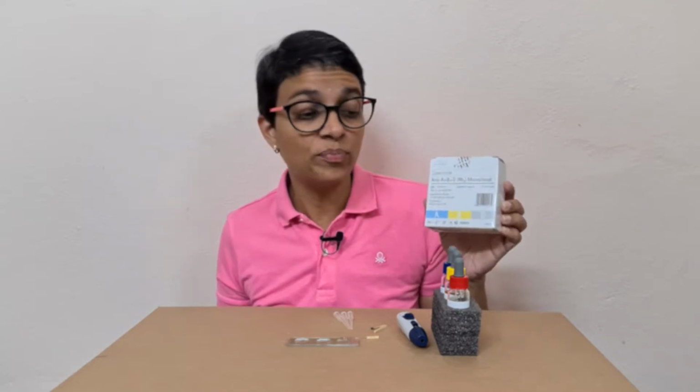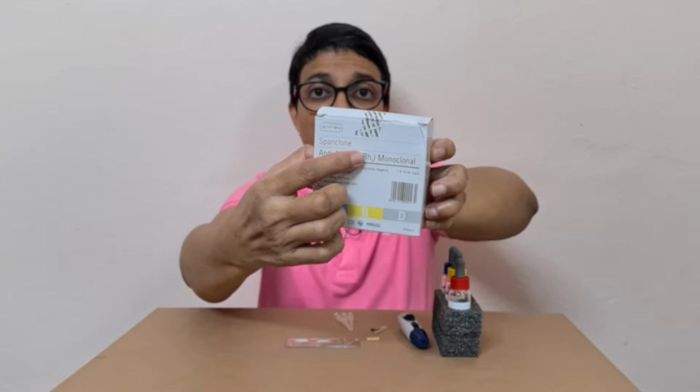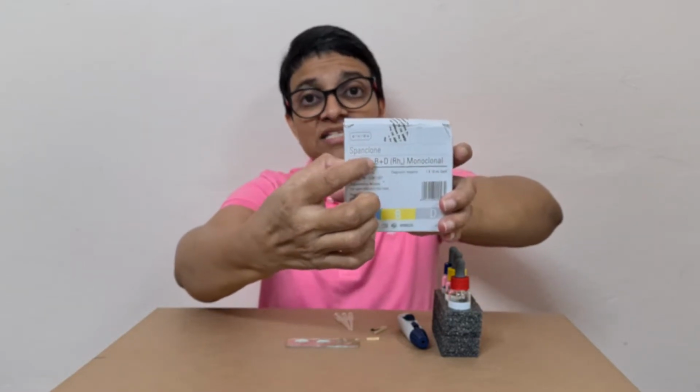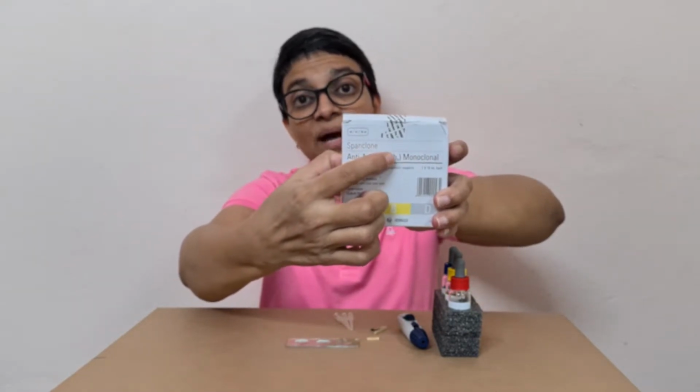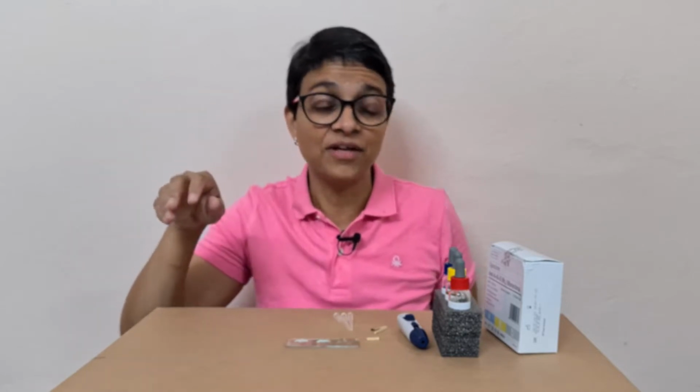To perform the ABO blood group typing, we will be needing an ABO blood grouping kit. On the kit, it is written as A, B, and D. A and B stand for the ABO blood grouping system, and D stands for the RH blood grouping, wherein we say that the person is A positive or B positive or B negative.